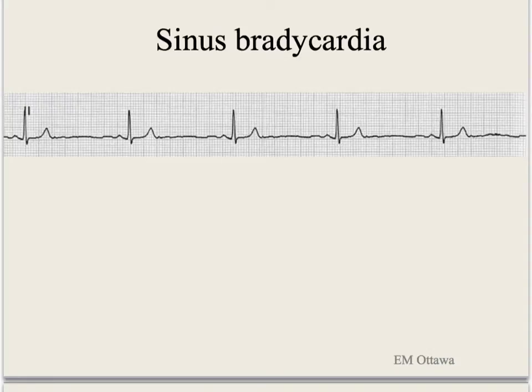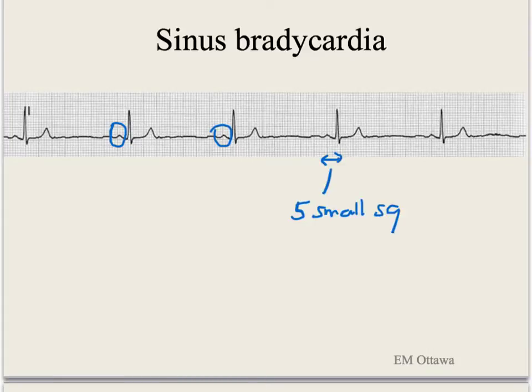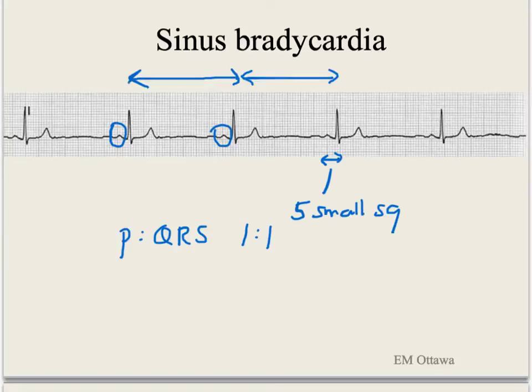The first rhythm is sinus bradycardia. The SA node is generating a slower than 60 beats per minute rhythm. Since it comes from the SA node, there is a P wave. The PR interval is normal — less than 5 little squares. There is a P before each QRS and a QRS after every P. The RR interval looks regular, and the QRS is narrow.